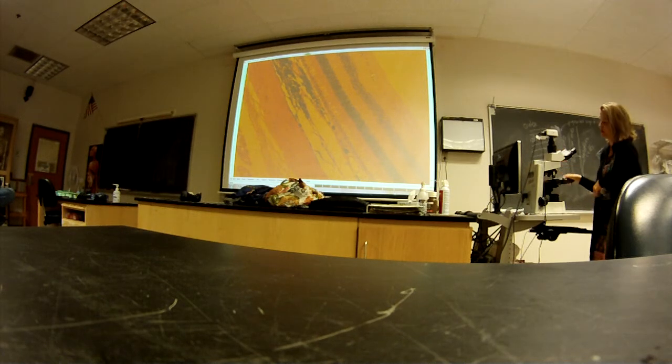Okay, so let's go back to this then. So then, once again, these are the nuclei of bipolar cells. Good. These are the nuclei of what kind of cells? Ganglion. Okay, what main layer is this? Sclera. And these are nuclei of what cells? Rods and cones. Good. And this main layer is? Choroid. And what about this small sublayer? The pigmented layer of the retina. Very good.